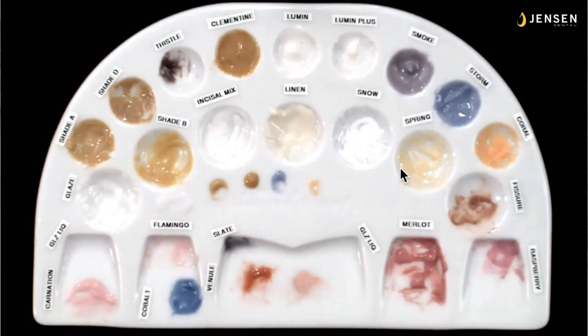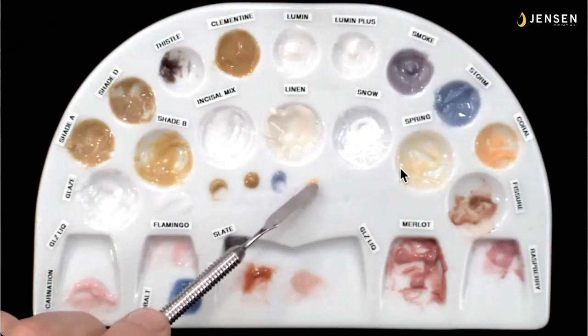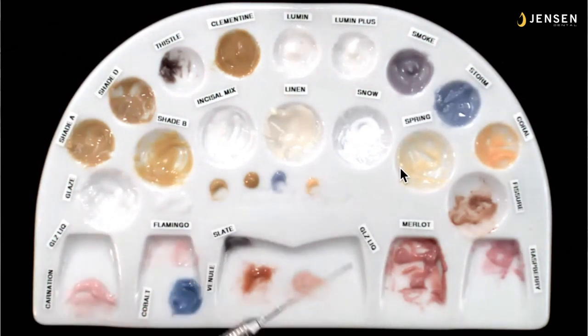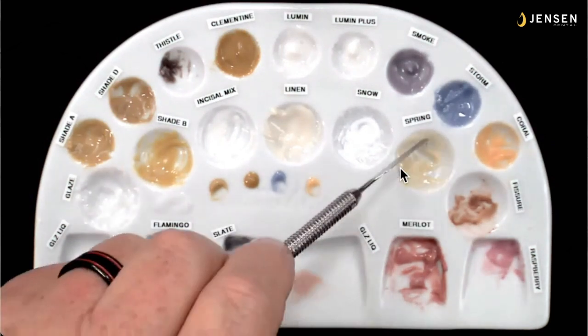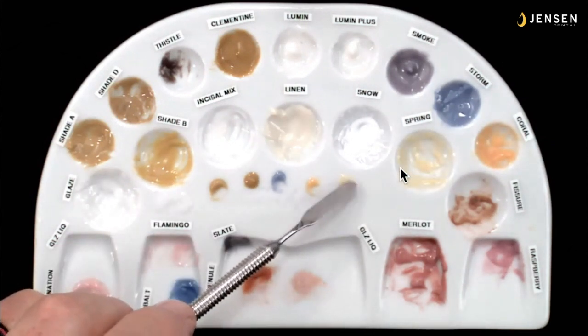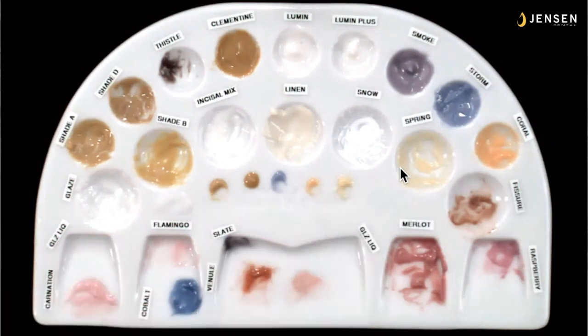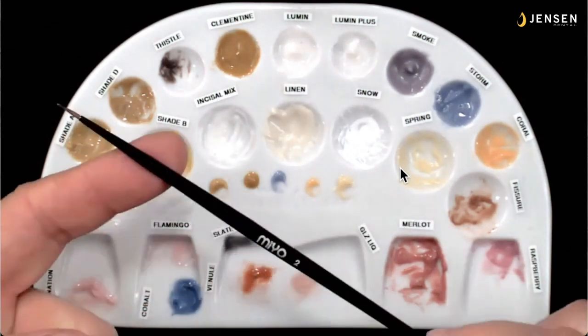A little bit of coral there for a mamelon effect. And I can always put just a little bit of the InSync glaze liquid in there with my brush and just kind of pat it. And when you see it start to move, kind of jiggle just a little bit to where it'll flow, you want to stop. You don't want to over thin this.